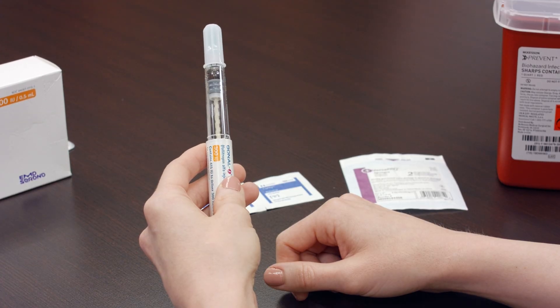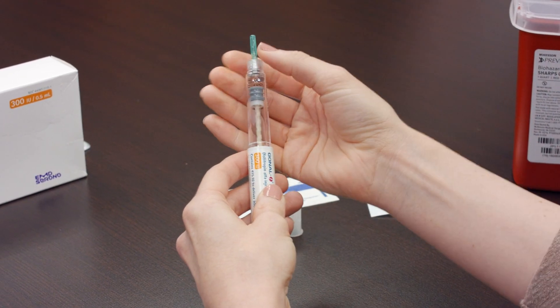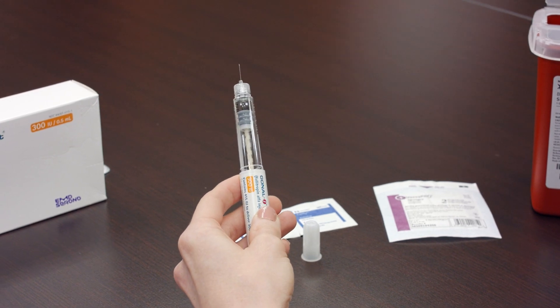There is an outer cap and inner cap covering the needle. Carefully remove the outer cap, followed by the inner cap, but keep the outer cap as you will use it later for disposal of the needle.